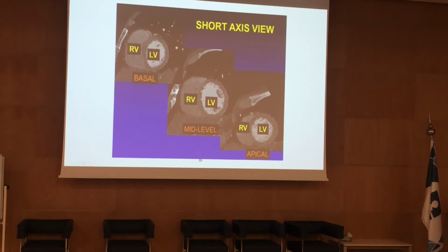In CT, we can have static images, and we can have moving images. So you can assess the heart while it's moving in CT, like echo. But the issue with that is giving more radiation, because we're recording the whole cycle of the heart, systole and diastole. So we like to minimize the radiation to the patient. So we just specify what we want. If we need function, we have to do the full cycle.